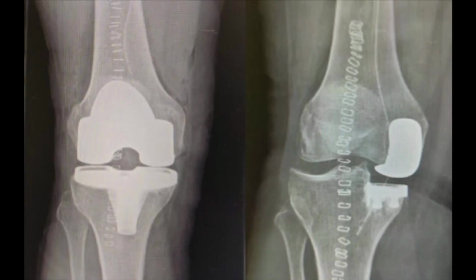We must therefore understand that knee osteoarthritis can affect a limited or much larger area of the knee. Depending on the specific case, we have the choice of implanting a partial or total prosthesis.